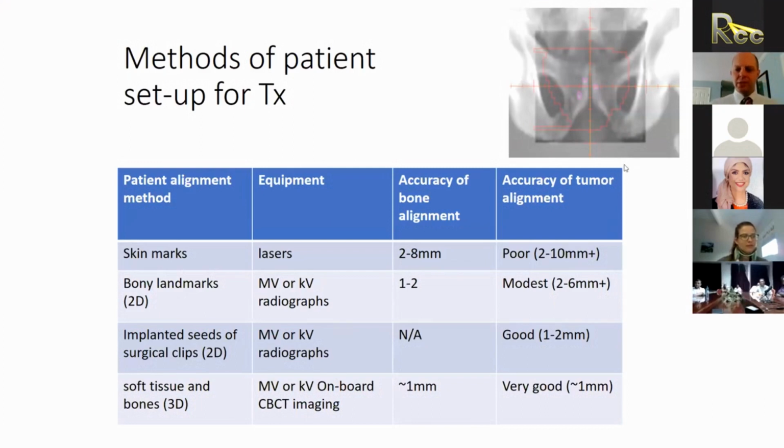The cone beam can be a full field of view or a smaller field of view, and it could be a full rotation or a half rotation. There are lots of different options out there, and often you can control how high the resolution is. But your number of slices, as you mentioned, since it's a volumetric scan, your acquisition time doesn't change because it's just one large rotation. How it's reconstructed will determine your resolution in your superior-inferior axis.